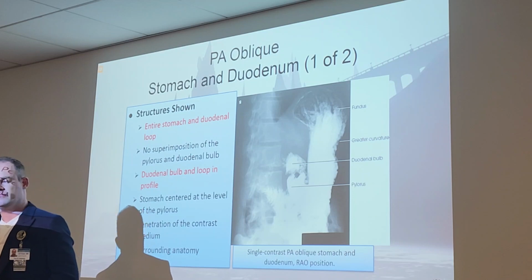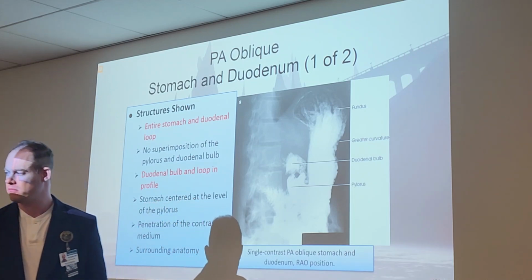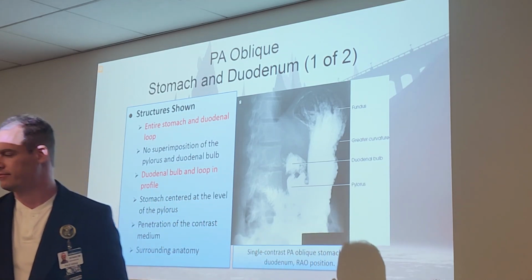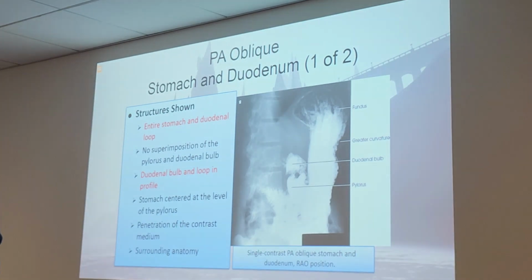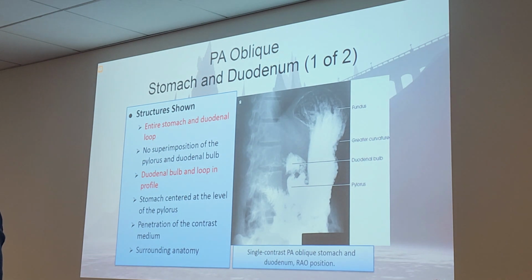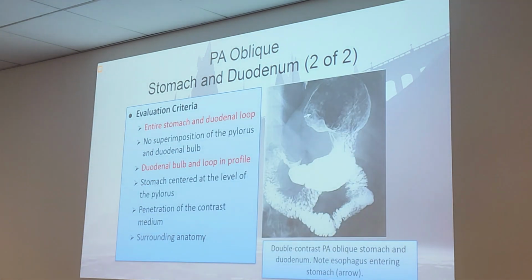In the book, I was doing the workbook and you have the stomach on this side and the loop on the right side. Was this reversed? Yeah. Might have been flipped, you should have to look at that. I thought it was the RAO. I think it was the RAO position. It might have been a flipped image. You have to show me.